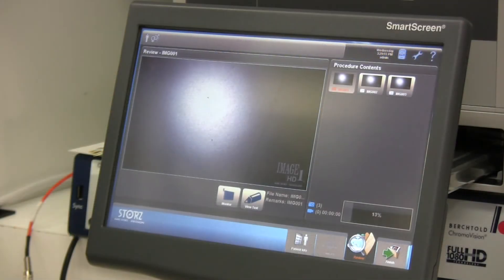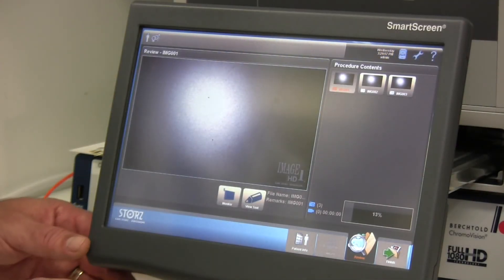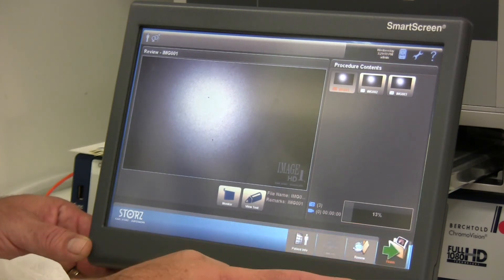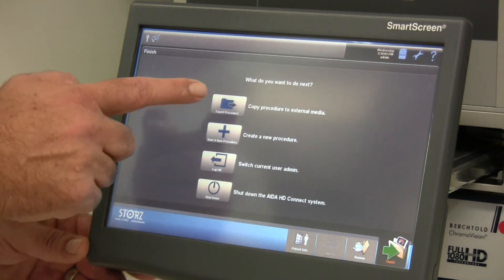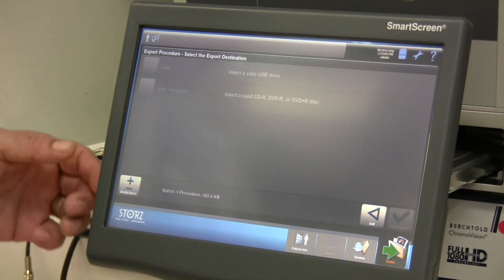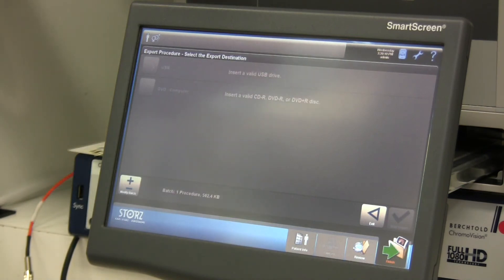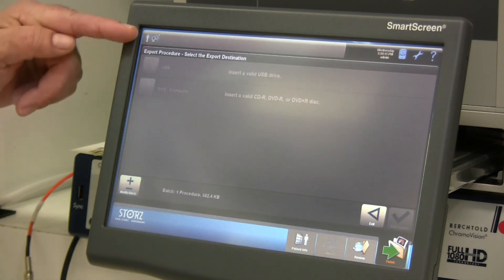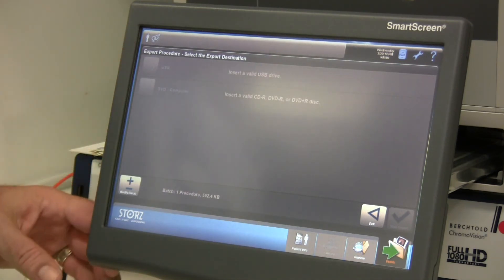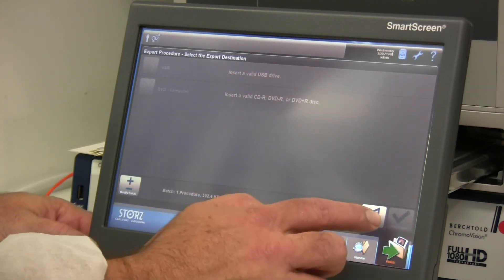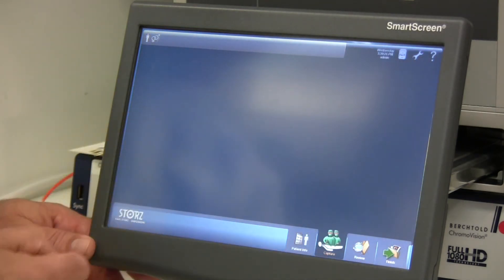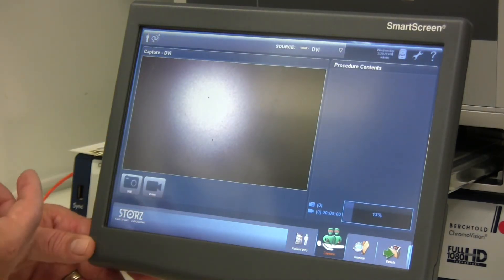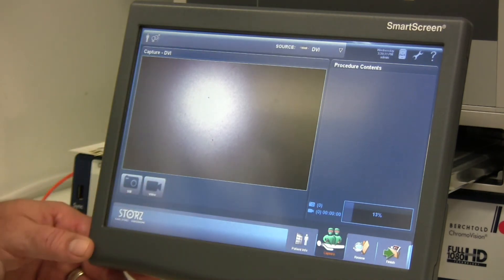The last step in image capture is finishing the case. Once I've completed my case, I press finish case and a series of questions ask me what I want to do. I have the option of copying the procedure to an external media — if a USB drive or DVD disc is in either slot, one of those areas will be illuminated and I can select it to export to portable media. My next option is to create a new procedure, which takes me back to a fresh screen to enter new patient information and start a new procedure.